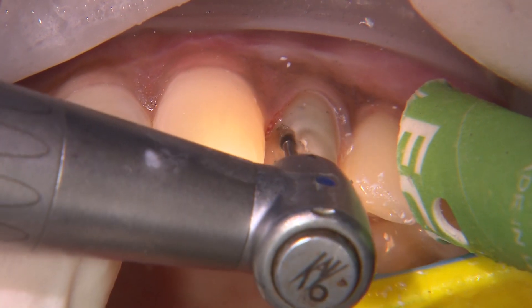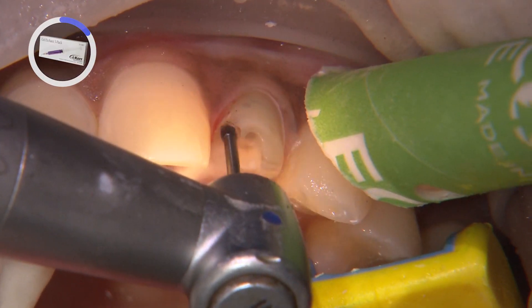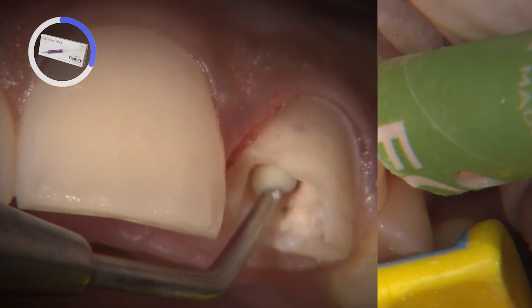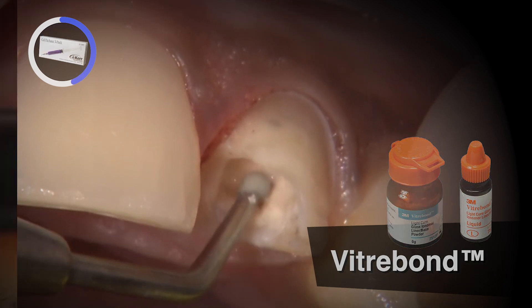To remove the temporary filling material on number 10, I use a carbide round bur at a slow speed. This helps ensure I don't remove much tooth structure beyond the temp material. Once I reach the gutta percha, I seal the top with Vitrebond glass ionomer.